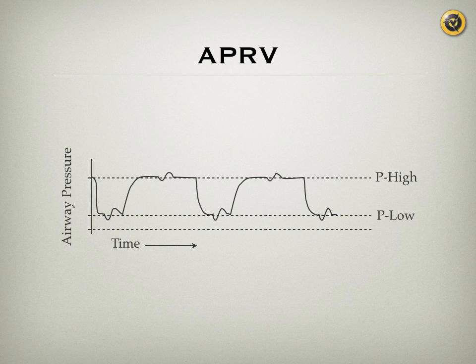pressure and inspiratory pressure, higher for a longer period of time and going down for a very short period of time. That means that they probably have air trapping, and hence they don't deflate all the way, so they recruit a lot more units that way, and these units stay recruited for a longer period of time. And at the same time, the machine allows the patient to take smaller breaths even during the high pressures and the low pressure.